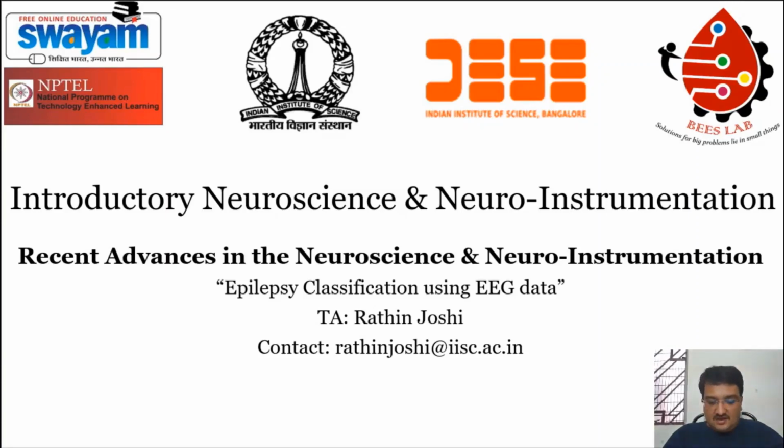For an epilepsy patient or epileptic subject, EEG is considered the gold standard. Of course, it depends on the progression of the disease and the actual status of the patient. But it is normal clinical practice that if somebody has a seizure, that person should undergo a video EEG or a long-term EEG test with respect to specific triggers, and the brain waves are recorded as per the system. There are many protocols, and they will observe and analyze.